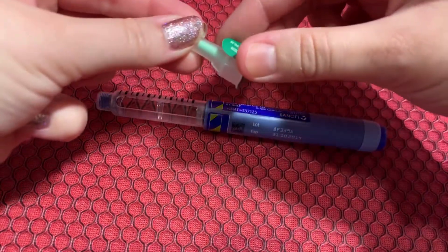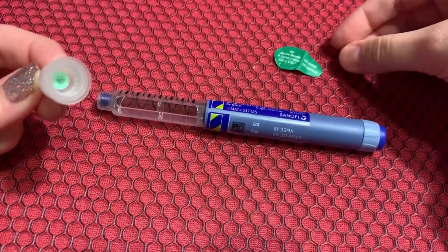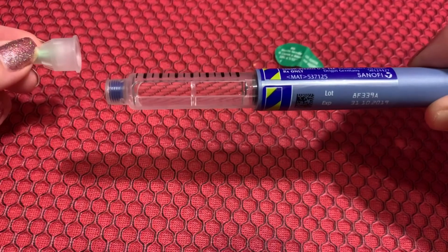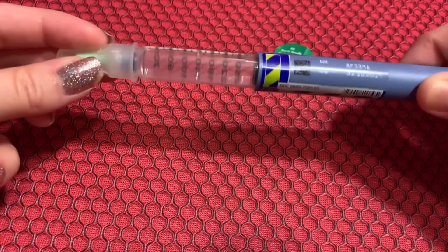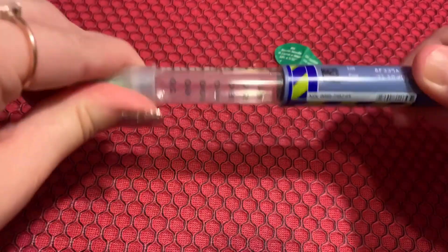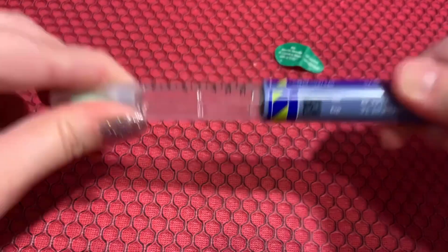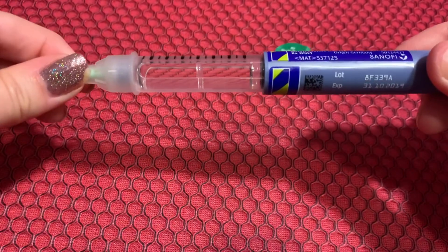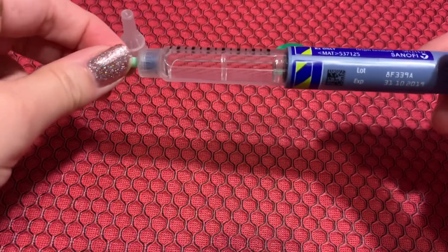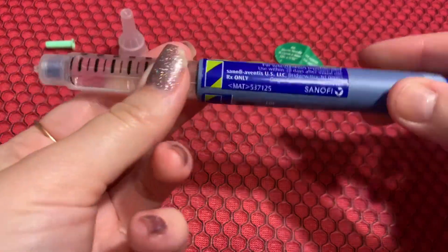Then get your needle ready. You can see it's got a little wrapper — just peel it off like this. Don't stick your finger in there. You can see on the pen there are little threads, and the needle is going to go on there — turn clockwise, righty-tighty. You might hear a little tightening sound, which just means it's on. You won't be able to turn anymore, and that's how you know it's on nice and tight. Then pull off the clear cap and make sure you save it. Then take off the needle guard carefully.